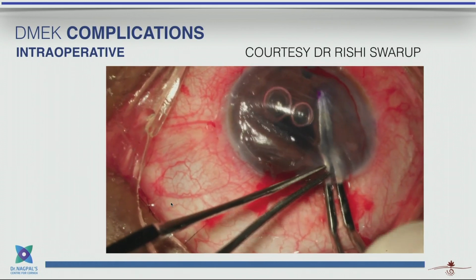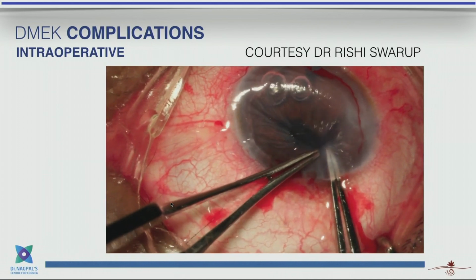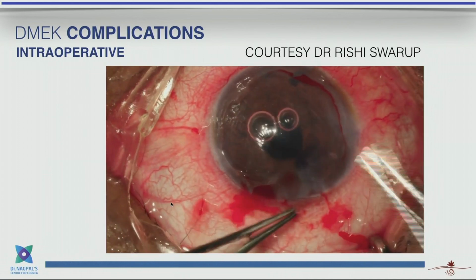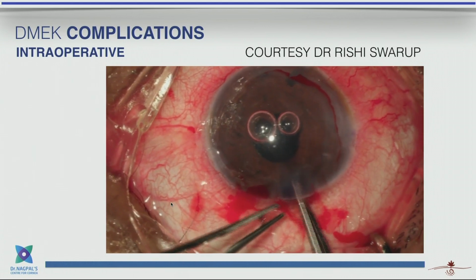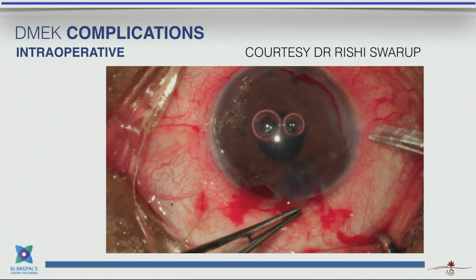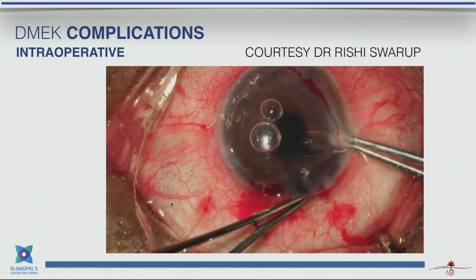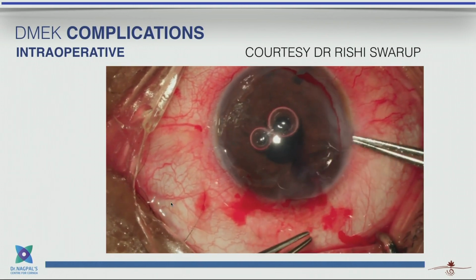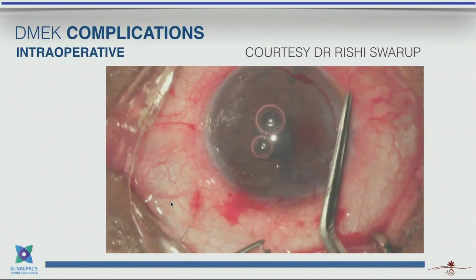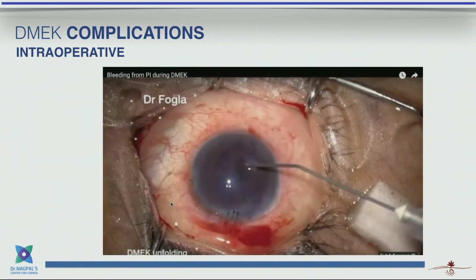So I think the problem with DMEK is similar, that if you have a small tunnel, it's a problem. If you have too large a tunnel and pressure, it can come out from the other end of it also. So you need to balance everything very carefully. And because it's all working on a capillary action, it's very responsive, the Descemet's membrane. So it keeps coming out.